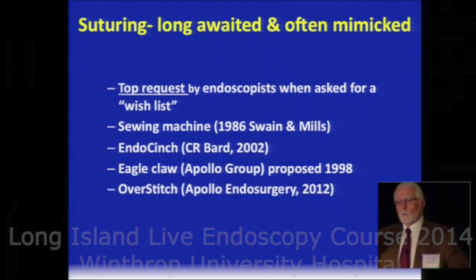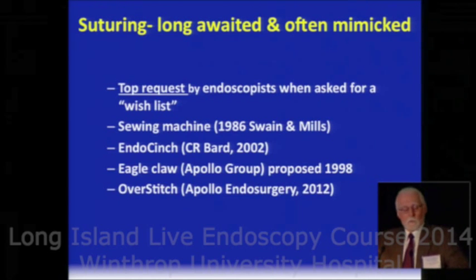If we ask all of you sitting here this morning, what would be your wish list? Invariably, a top request has consistently been, give us a mechanism to suture, just like the surgeons do. So it's a very desirable function.